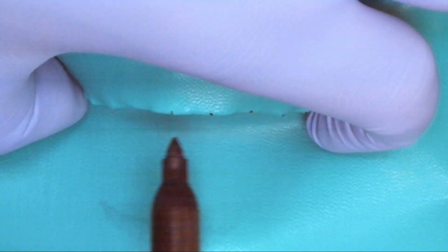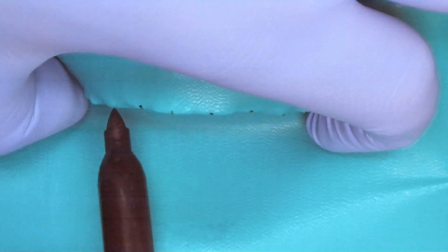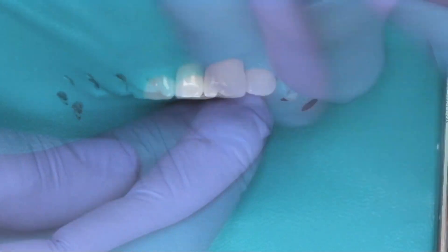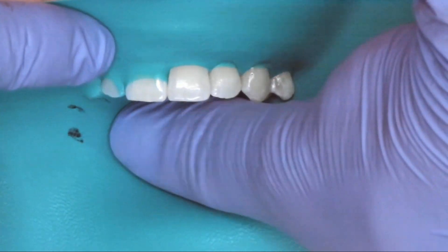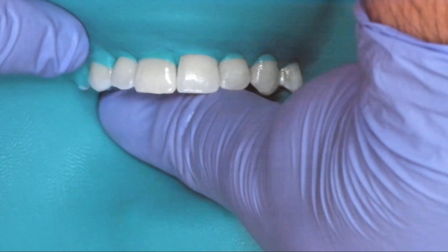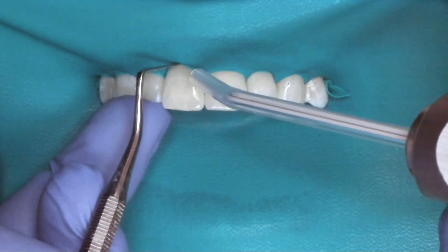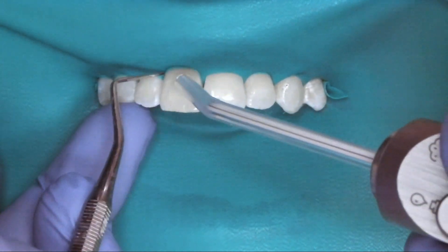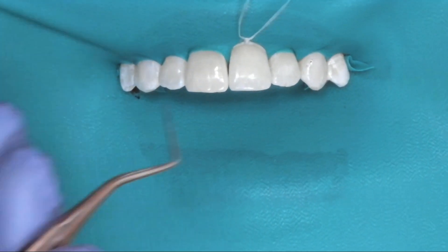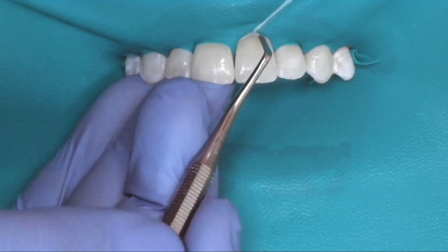Isolating the upper anterior teeth is actually a little bit easier. We have the same setup as before, but typically I don't need to use any clamps. Instead, I cut the edges of the rubber dam and use those pieces to wedge the rubber dam into place. This will definitely help secure the rubber dam, but if you have teeth with gaps in between, you may need a premolar clamp for that extra stability. If the decay extends under the gums, I use floss ligation to retract the rubber dam further cervically. This exposes the entire tooth so that I can visualize those hard to reach areas.